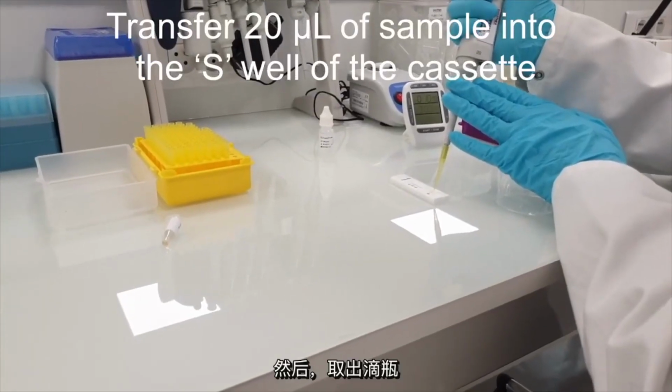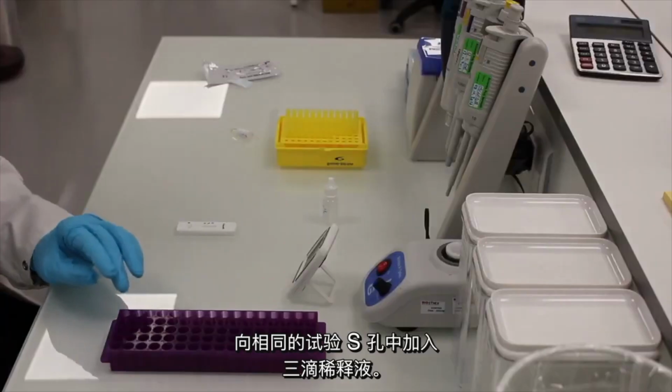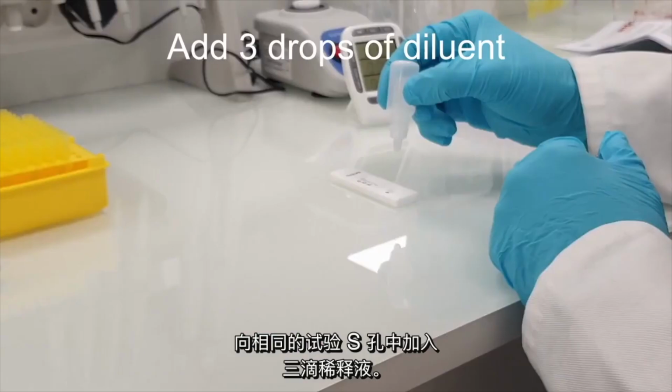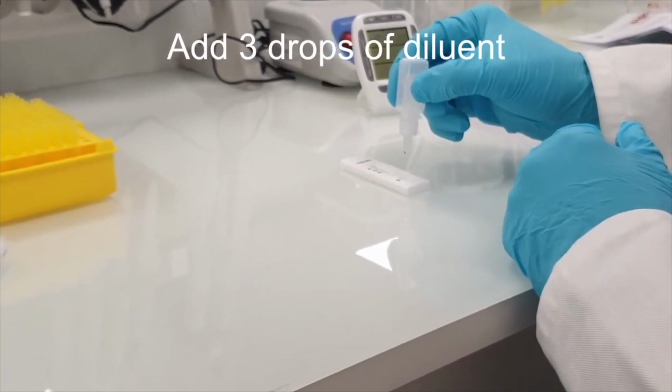And then you take the dropper bottle and you add 3 drops of the diluent into the same S-well of the assay.